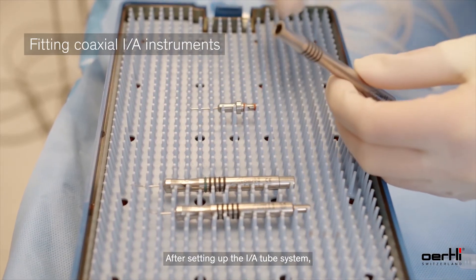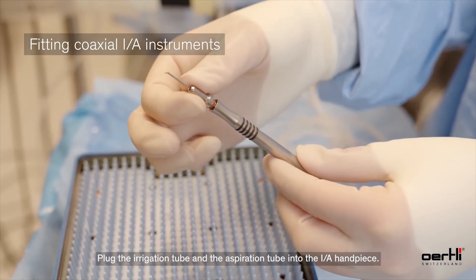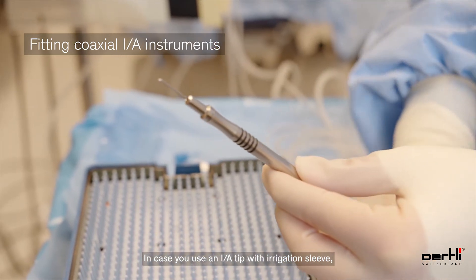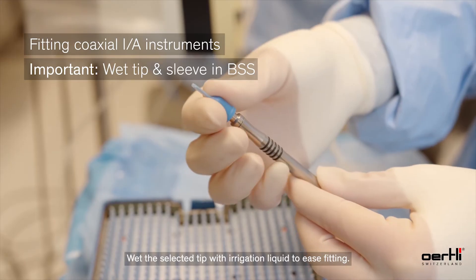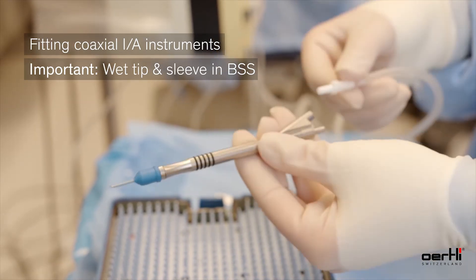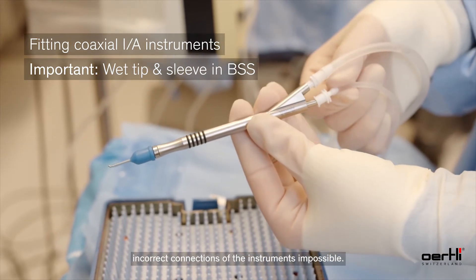After setting up the IA tube system, plug the irrigation tube and the aspiration tube into the IA handpiece. In case you use an IA tip with an irrigation sleeve, mount the irrigation sleeve on the tip. Wet the selected tip with irrigation liquid to ease fitting. The lure connectors are designed to make incorrect connection of the instruments impossible.